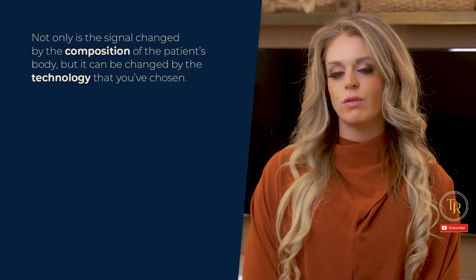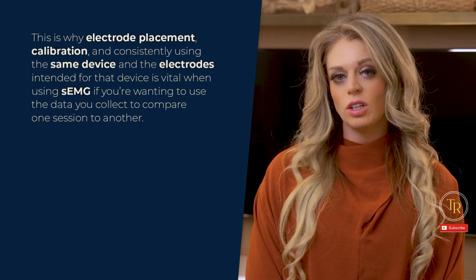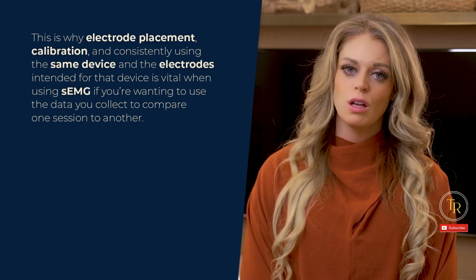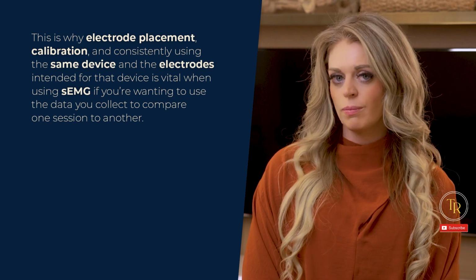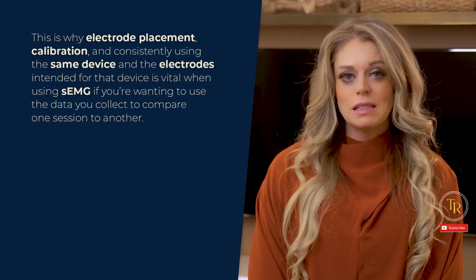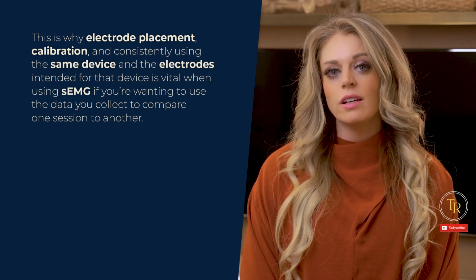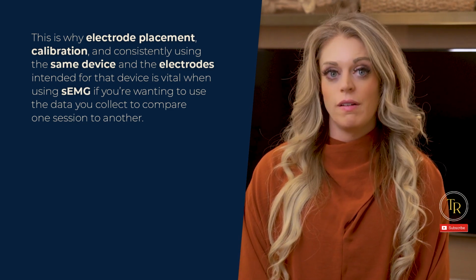This might look a little different from brand to brand. This is why electrode placement, calibration, and consistently using the same device and the electrodes intended for that device is vital when using sEMG if you're wanting to use the data you collect to compare one session to another. If you use one device on your patient for one session and another device 10 minutes later, you're essentially comparing apples to oranges, and their swallow may appear to have drastically improved or declined based on the representation of the signal, while we know change doesn't happen that fast.